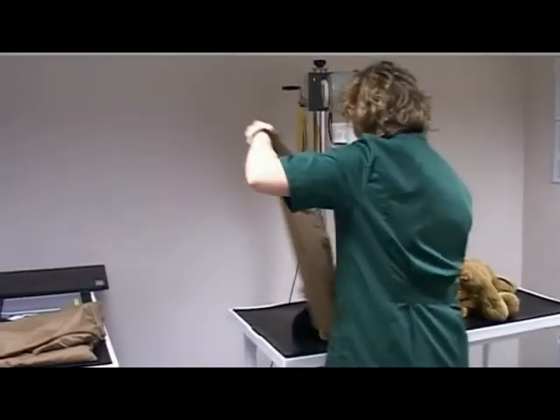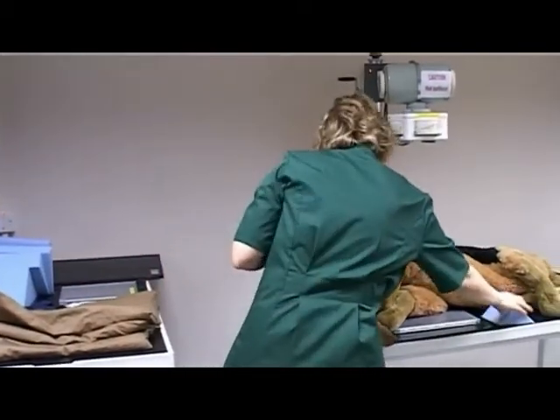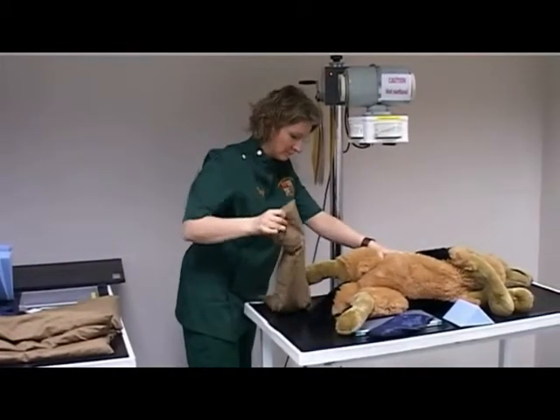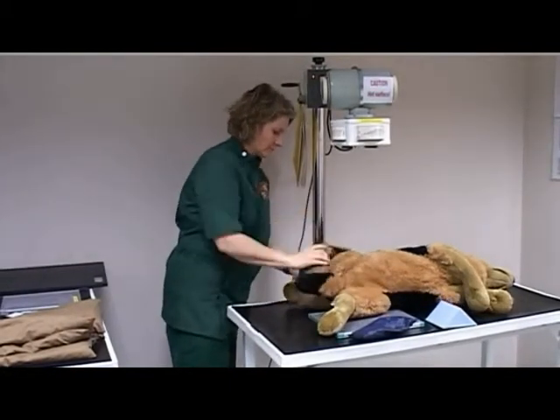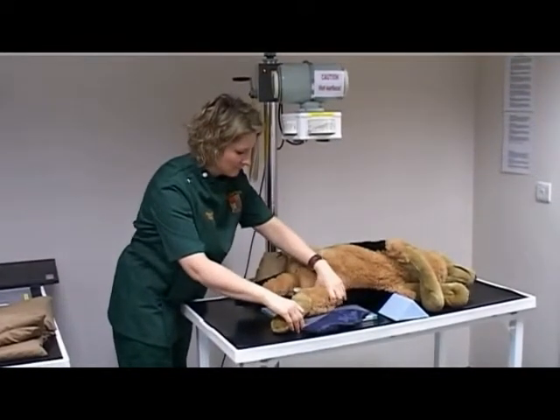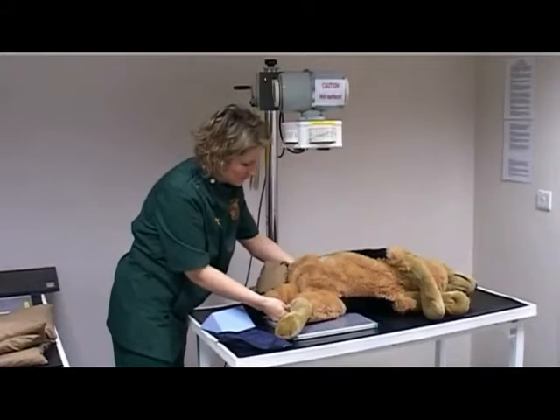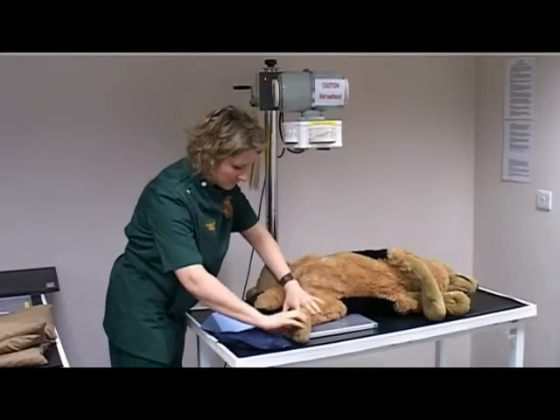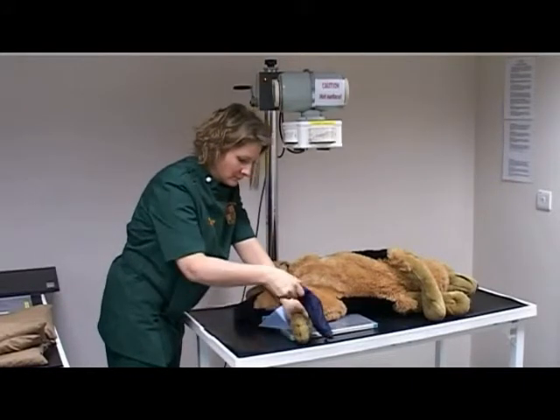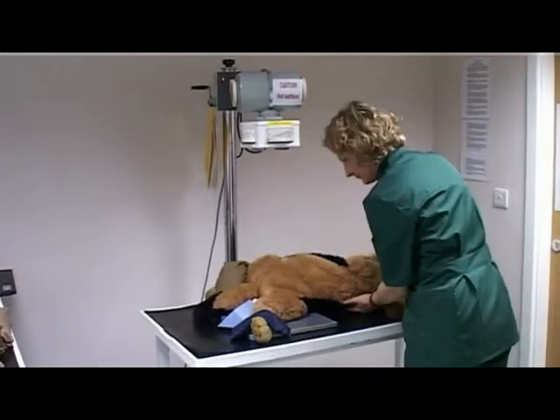Select the positioning equipment. The hind limb furthest away from the cassette should be drawn out of the way of the limb nearest the cassette and secured with a sandbag or tie. Leave the hind limb closest to the cassette in a natural position. Place a small foam wedge under the hock or stifle to correct rotation of the tibia and fibula, and place a sandbag over the foot to stabilize the hind limb on the cassette.